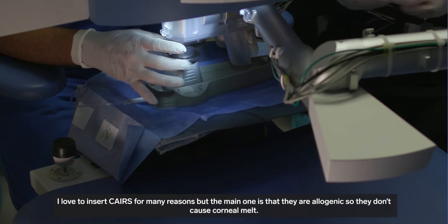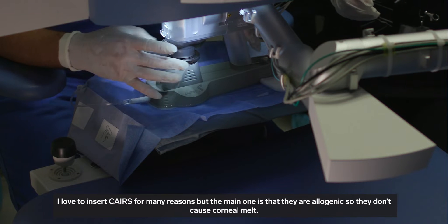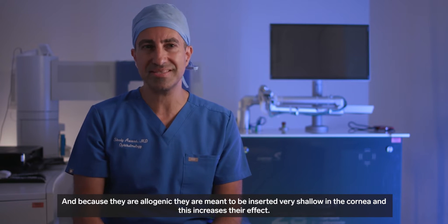I love to insert CAIRS for many reasons, but the main one is that they're allogenic, so they don't cause corneal melt. And because they're allogenic, they are meant to be inserted very shallow in the cornea, which increases their effect.